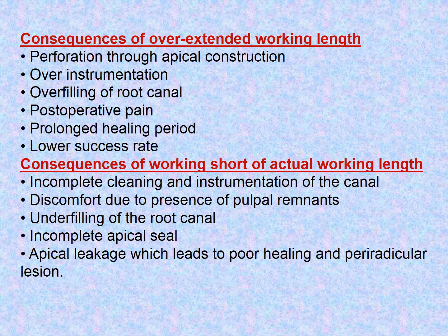Now, consequences of overextended working length: first, perforations through the apical constriction, over-instrumentation, overfilling of the root canal, post-operative pain, prolonged healing period, lower success rate.